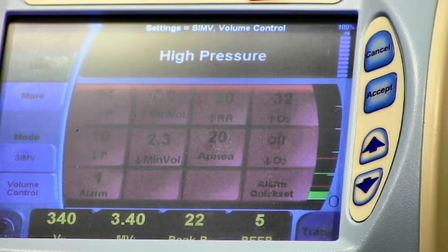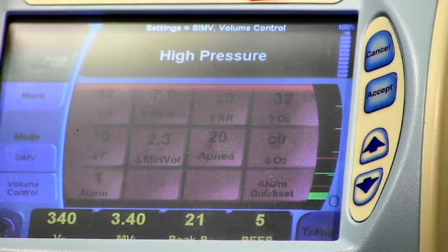When we're transitioning to our cot, we're transitioning to the ambulance. We're vibrating down the road, potentially with lights and sirens. Even though they can't express their irritation internally, they may still hear it or feel it and subconsciously recognize that change and then display it as things such as biting on the tube or moving their head or trying to breathe hard because they're stimulated. So in those situations, again, do consider increases in sedation and in pain control and potential paralyzation once you've achieved adequate sedation.